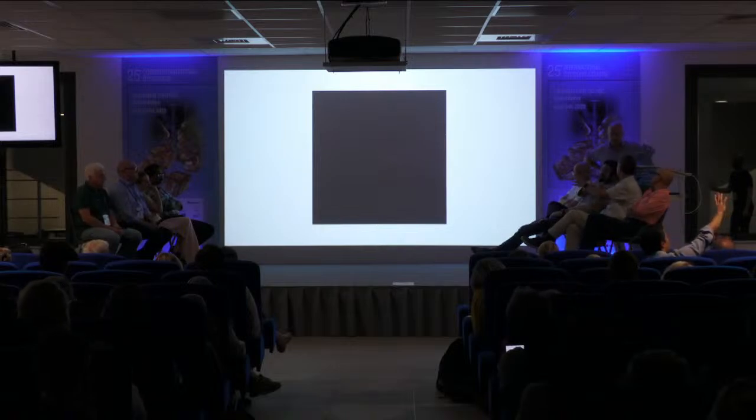This is a good case where you've got a healthy tympanic membrane, everything's autologous, and you don't need to get a prosthesis, provided the fit and stability is good. I mean, everything's perfect in this case, apart from this fracture.